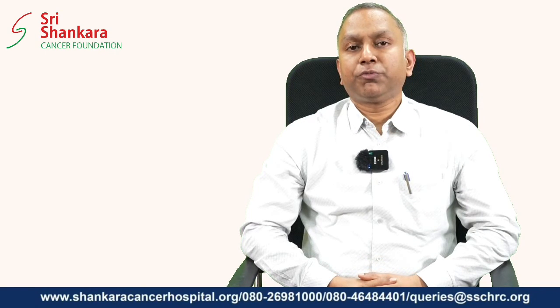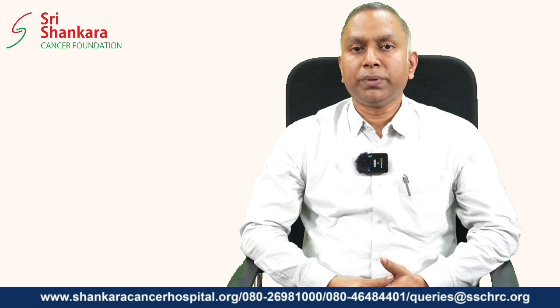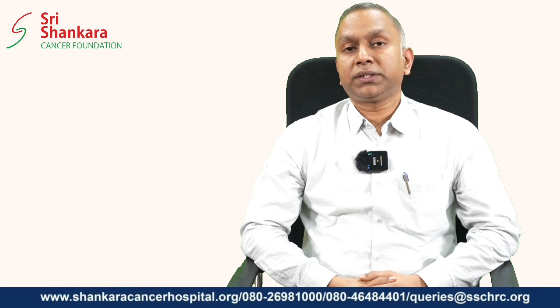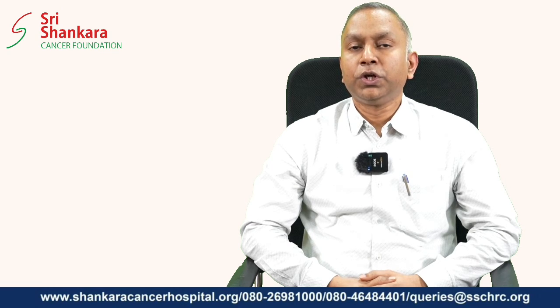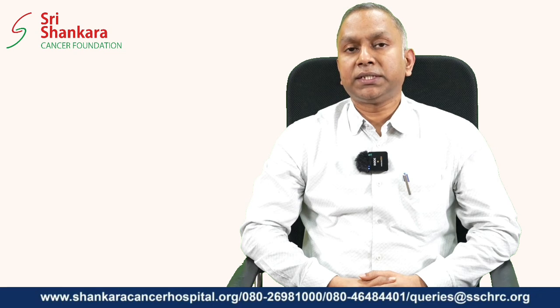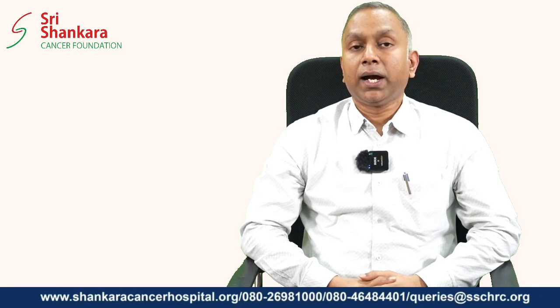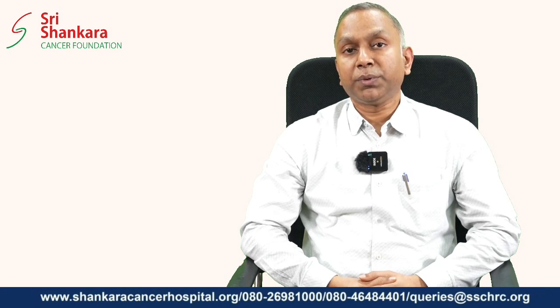So, the advantages of brachytherapy. Brachytherapy could be of any form. It could be intracavitary, or interstitial, or intraluminal brachytherapy. The biggest advantage of brachytherapy is the rapid dose fall-off. What does it mean? The dose is precisely delivered in very high doses to the tumor itself, and the adjacent normal structures will get very minimal radiation from the brachytherapy.